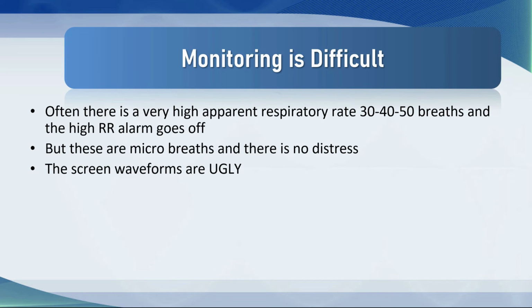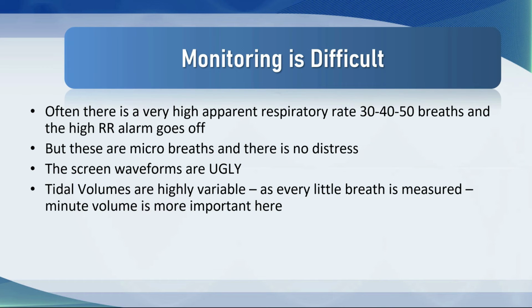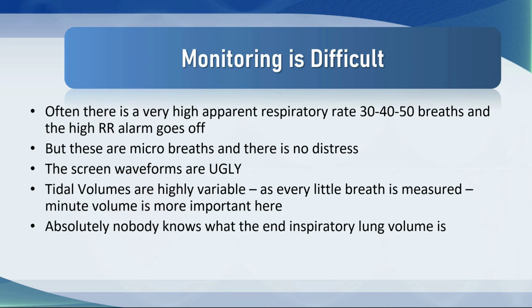The screen waveforms are really ugly, and I've spent a lot of time in this course showing you different waveforms that you can analyze looking for patient ventilator dissynchrony. In this mode of ventilation, it's impossible to do that because the patient never really synchronizes and everything looks ugly. The pressure waveform looks ugly, the flow waveform looks ugly, the pressure volume curves, the flow volume curves, they all look ugly. You just got to live with it. And because the tidal volumes are highly variable, every little breath is measured, and a minute ventilation is more important than tidal ventilation on this mode.